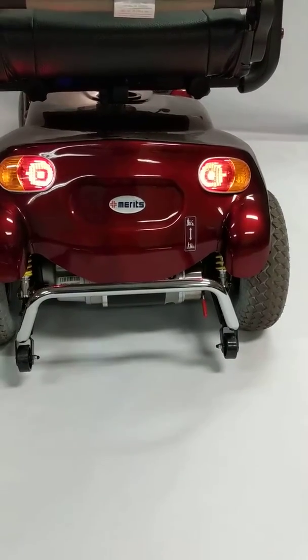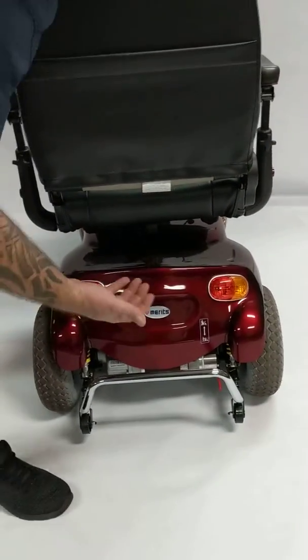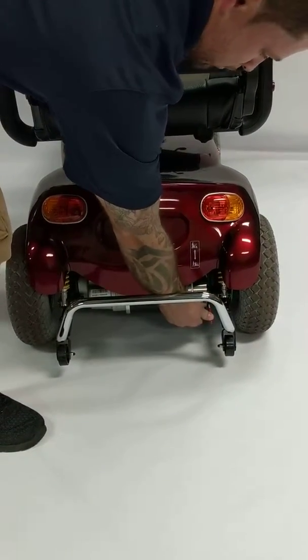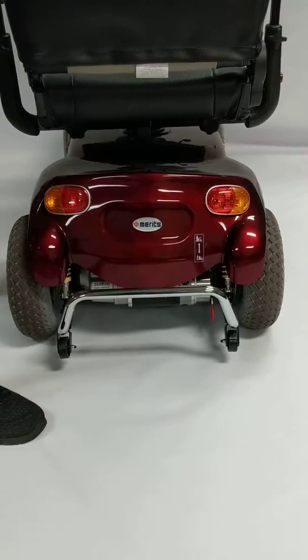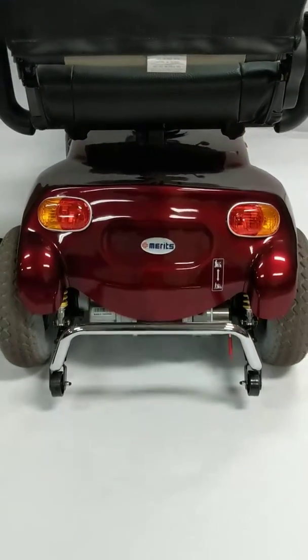You also have, in case your batteries die out — and this is on any mobility scooter — this is called your electromagnetic brake. Go ahead and put this in the opposite position, and now I can manually push the scooter in case I ran out of battery or there was some sort of malfunction.